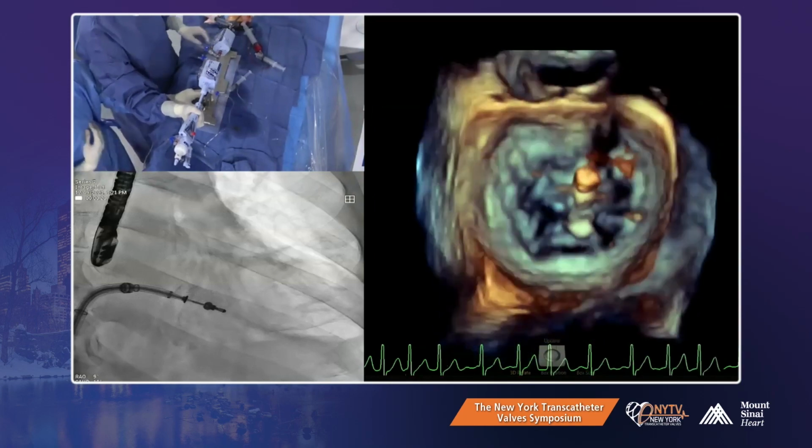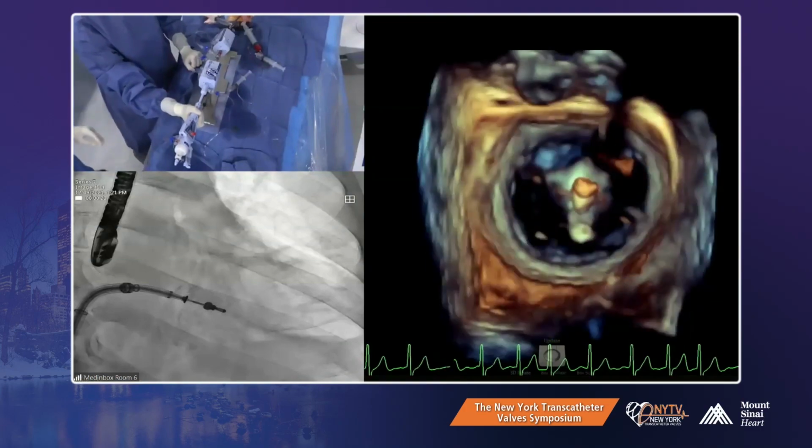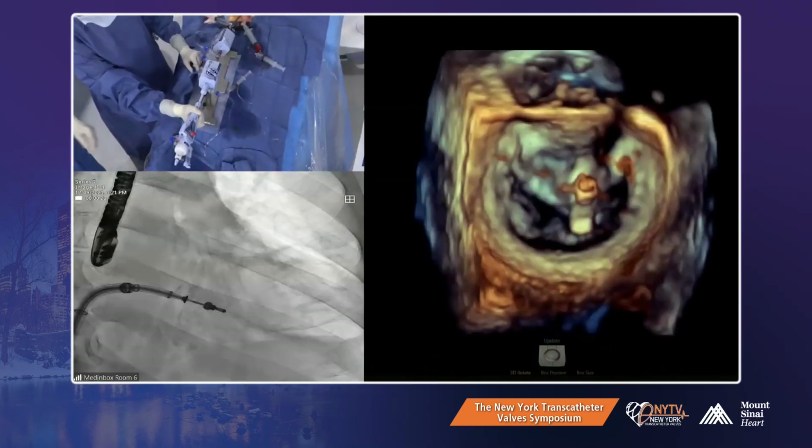Okay, good. Okay. Clockwise. Okay, we move to ACT level targeting. We are counterclockwise a little bit. Yeah, it's about 290. Now it looks close to 300. A little overclocked.